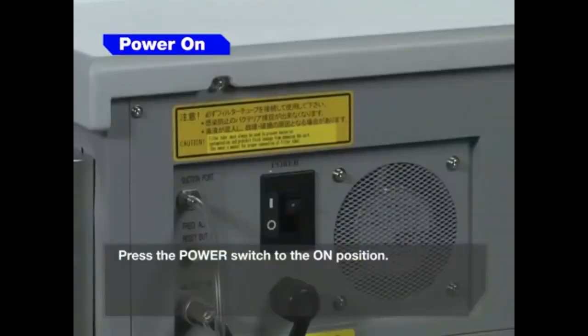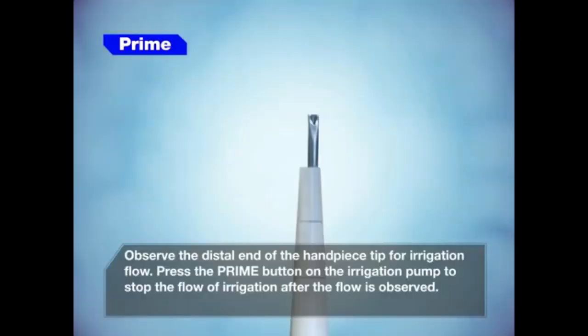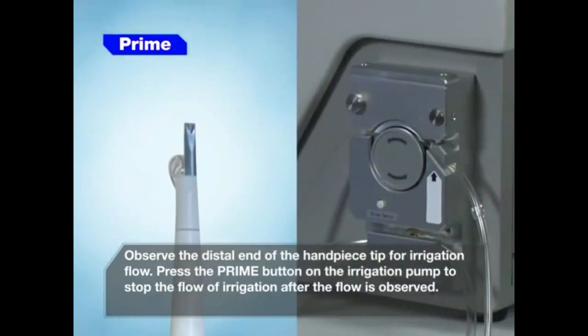Press the power switch to the on position. Press and release the prime button on the irrigation pump. Observe the distal end of the handpiece tip for irrigation flow. Press the prime button on the irrigation pump to stop the flow of irrigation after the flow is observed.